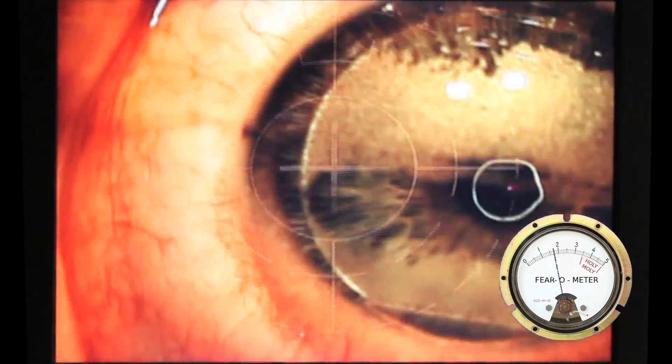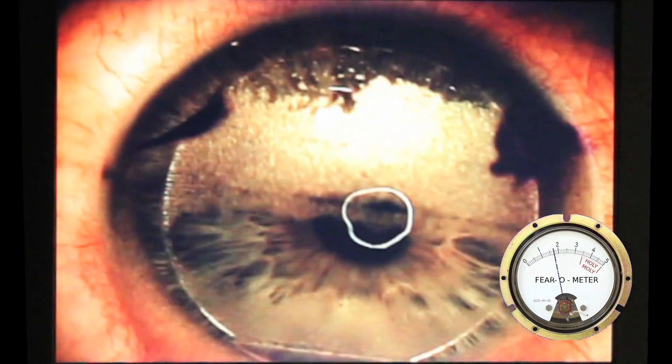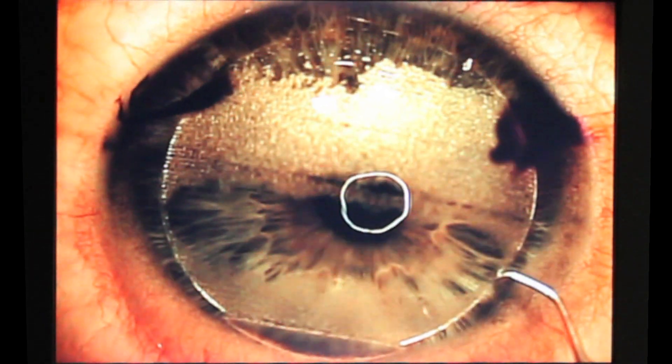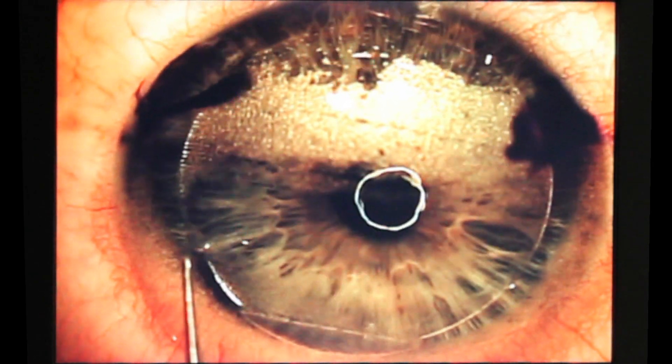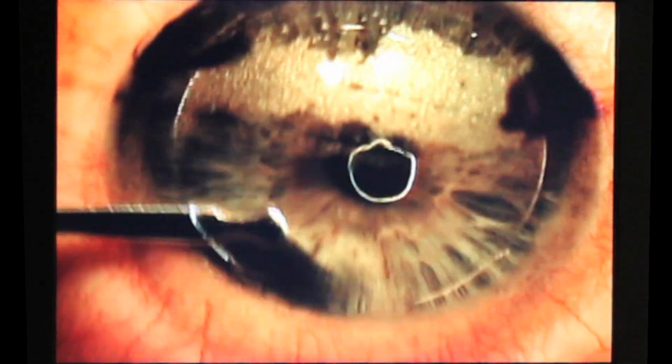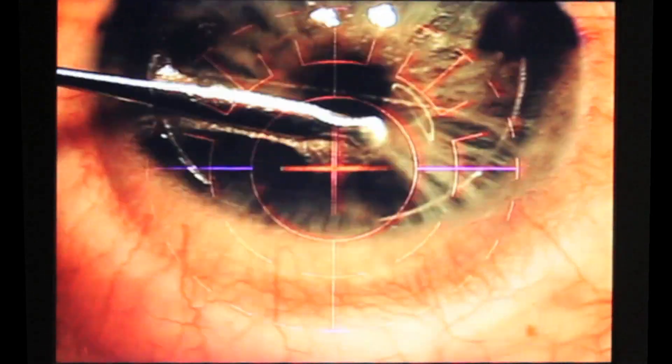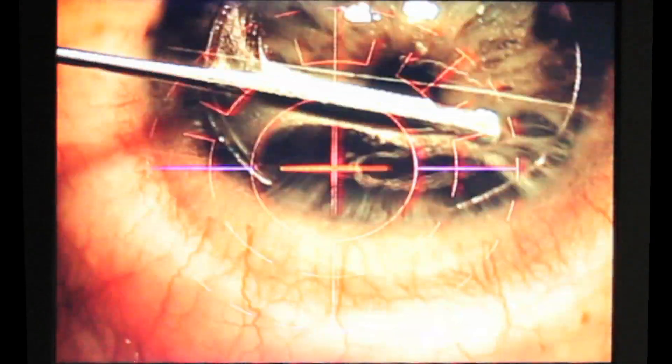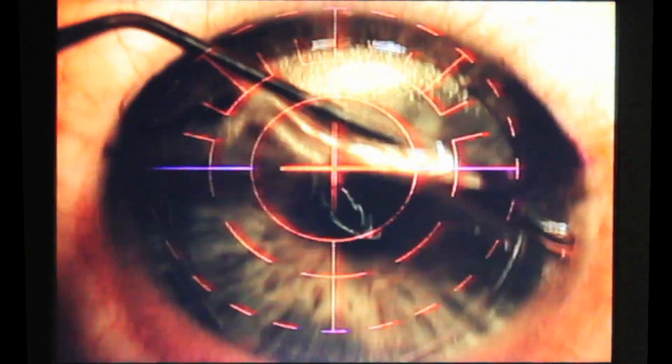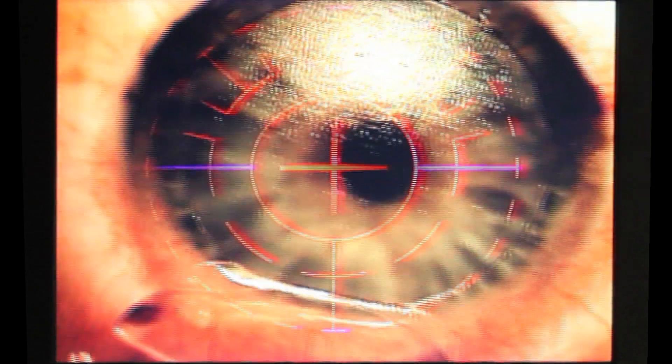So, at that point you feel kind of like a wounded puppy. And you just want to go somewhere. Here we'll do the same thing in fast motion here. So, you can see, mark it, mark it, and then pull that joker back. My wife can't watch this. She does a lot of surgery, but she doesn't do eyes for some reason. She could amputate your leg, but she couldn't take a splinter out of your eye. That's the funniest thing. It looks like he's playing tug of war with my eye. I wonder what happens when they rip the flap off on accident, if that ever happens. I guess this is one reason you definitely want a guy with a lot of experience.